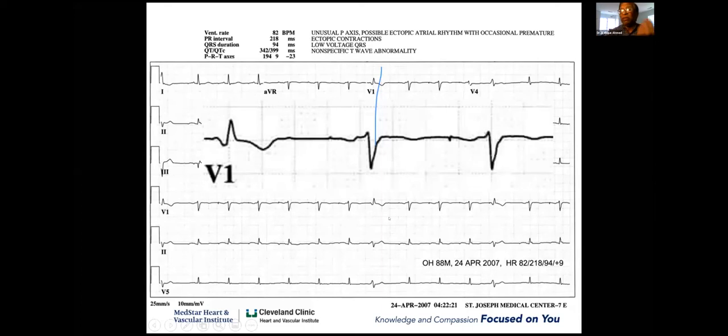Modern ECG machine filtering is problematic. And also because of the bipolar pacing, and not only that, most of the pacemakers these days have auto capture. In the old days, we programmed pacemakers at 2.5 volts. They don't necessarily program at 2.5 volts. They program at a very low voltage, like 1 volt, 1.2 volts, a little bit above the safety margin. And I kept the report.